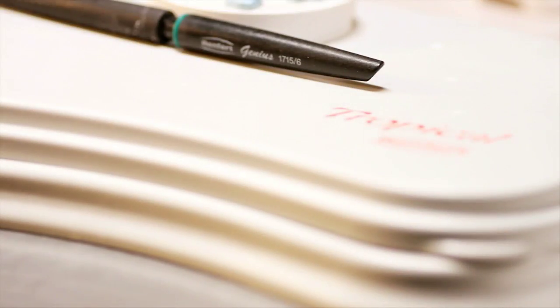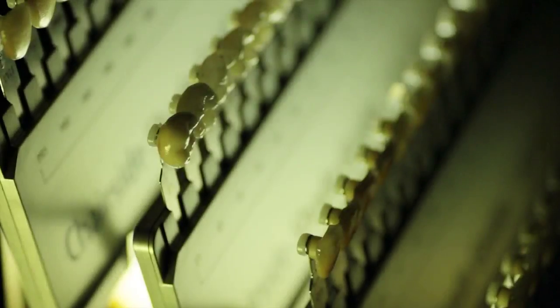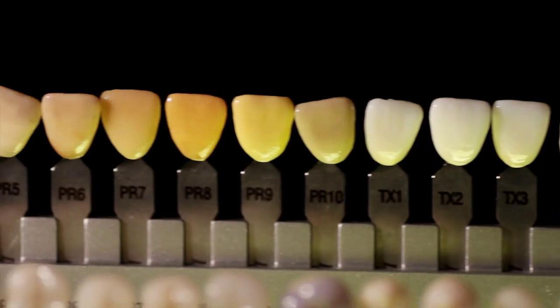The 5 individual guides are modeled to a specific age group based on their general dentition. To make the process even easier to use, there are various shade tabs for premolars and molars, after prep color, surface textures, and tissue colors. The finished product is a naturally aesthetic and visually appealing restoration.